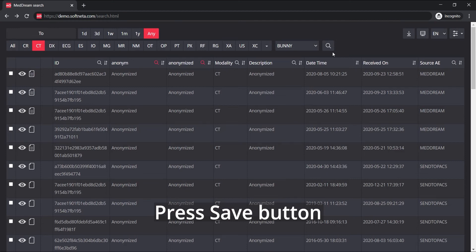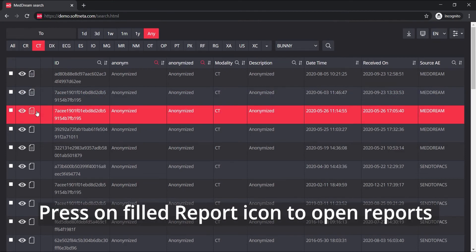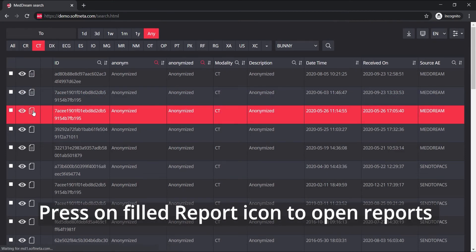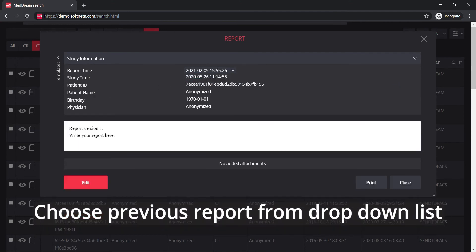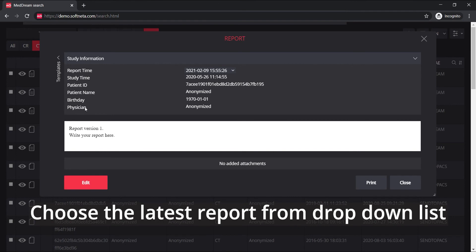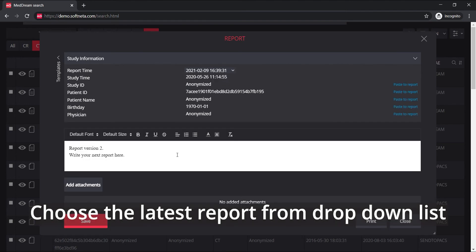Press on the filled report icon to open saved reports. Choose a previous report from the drop-down list in the report time section, or choose the latest report version from the drop-down list.